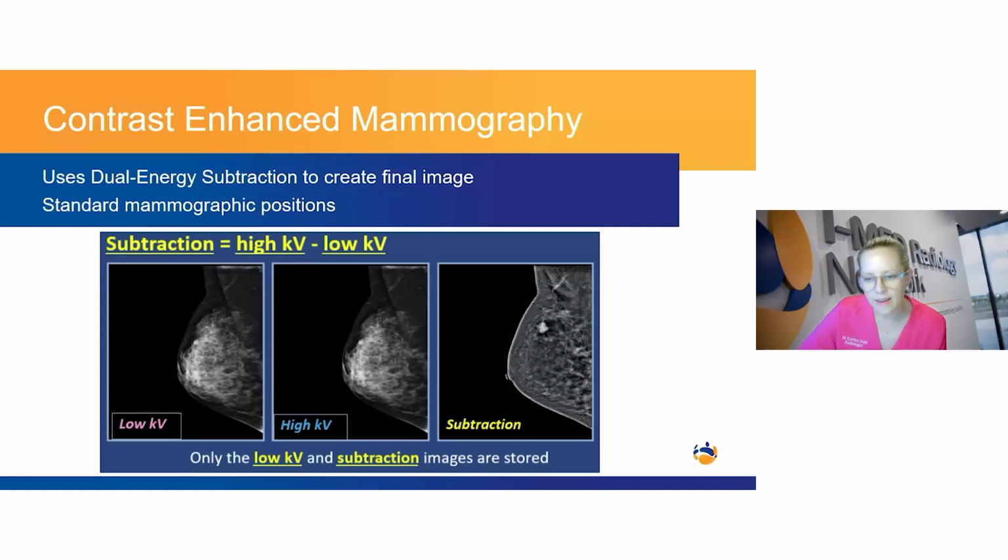And as you can see, we have this nice bright enhancing lesion superiorly in that breast, and all the other areas of white are actually the background parenchymal enhancement. So that's active breast tissue. And obviously, the more of that we have in an image, the less accurate the study is. But you can see that there is a difference between the degree of enhancement of the background and the degree of the enhancement of that lesion.